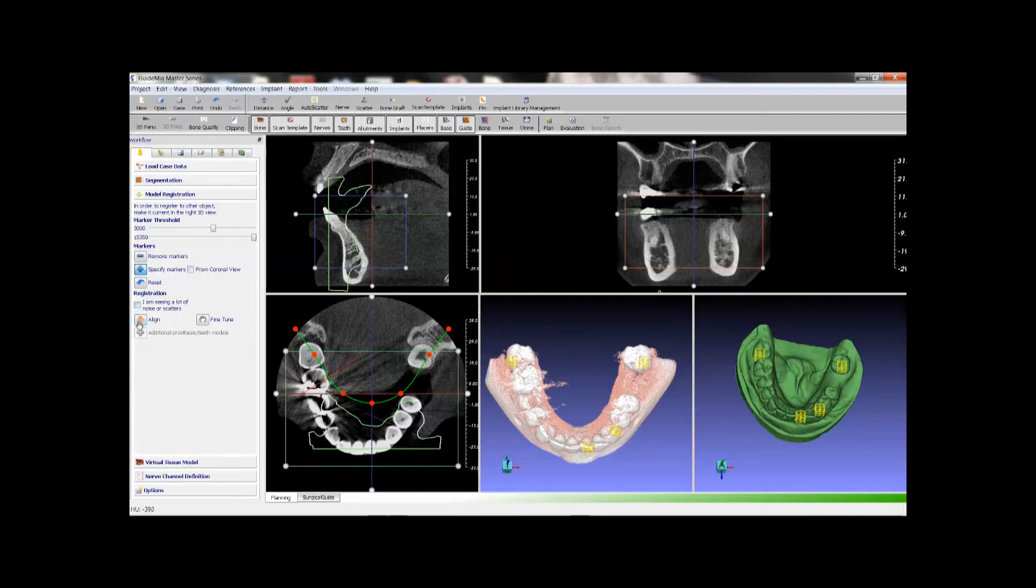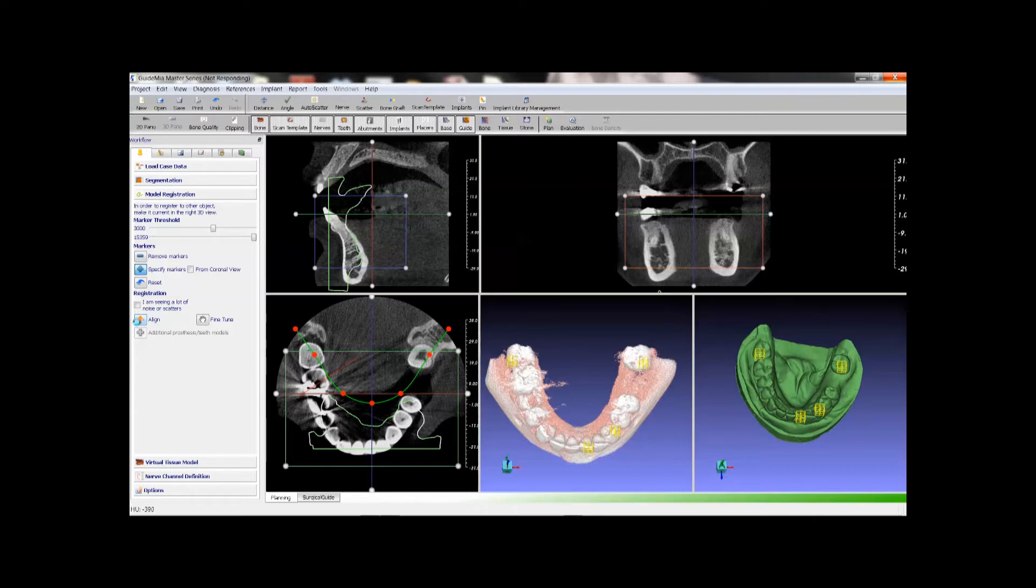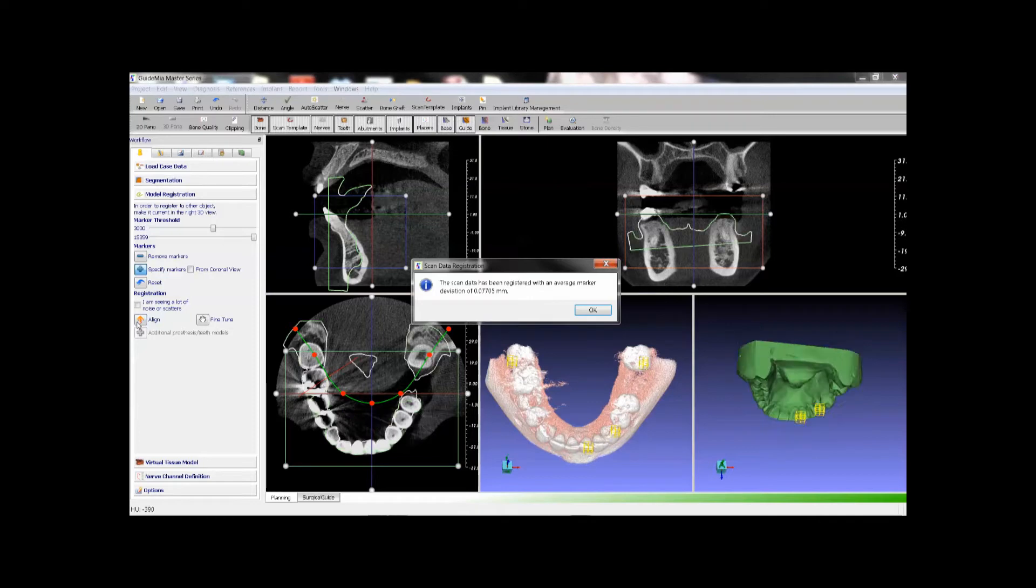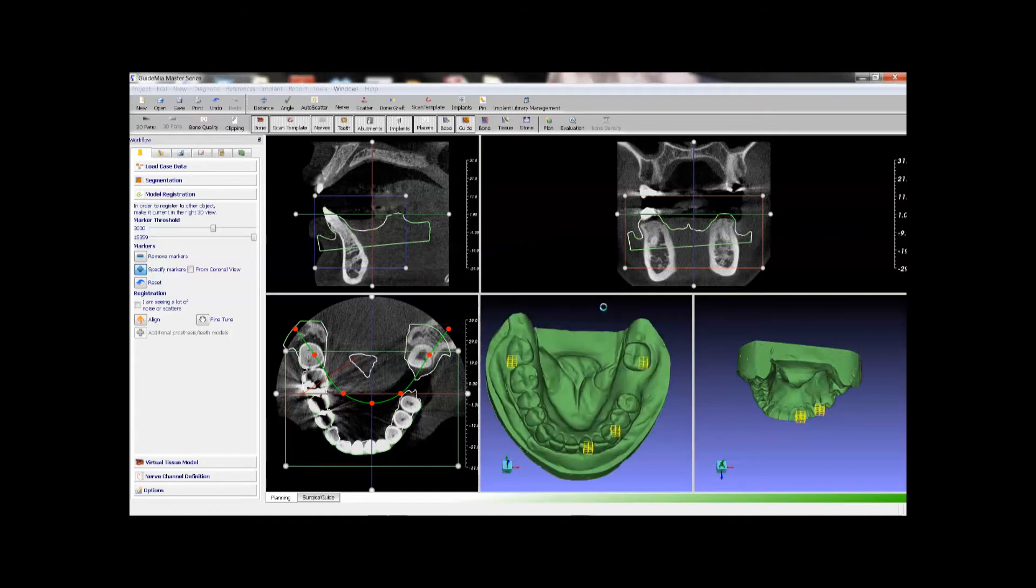Then we click the align button. Typically the operation will take less than a minute. Actual time depends on how the markers are specified and how different the initial orientations of the scans are. Now the registration is done, the system tells us there is about 90 microns deviations between the two scans in the marked areas.